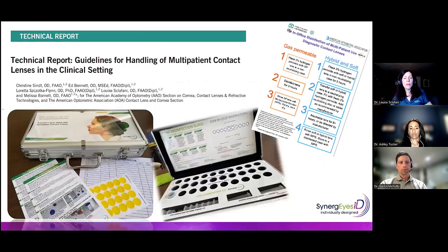One final thing I want to mention is that this lens is an empirically designed lens. You don't have to use trial lenses that you put on one patient and then on another patient.